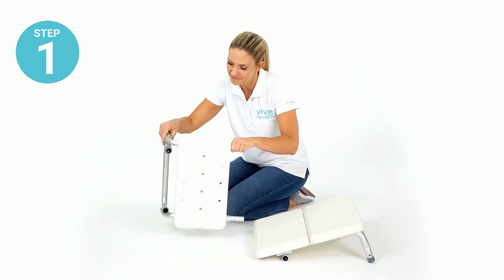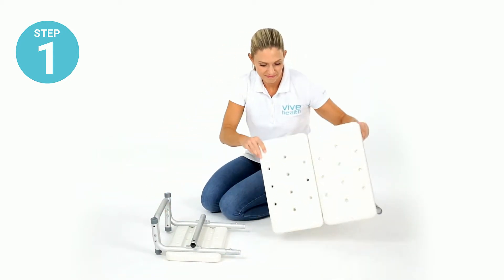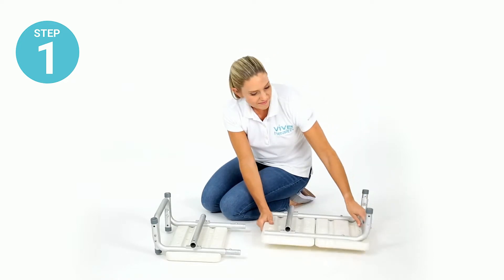Step one: turn the seat sections over so that each of the leg sockets are facing up.